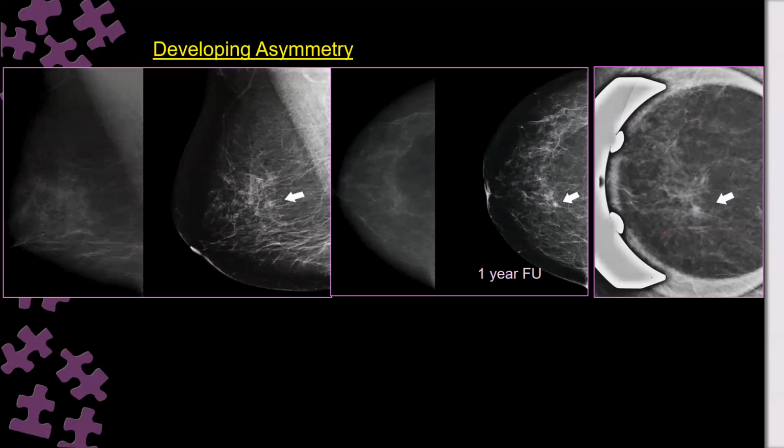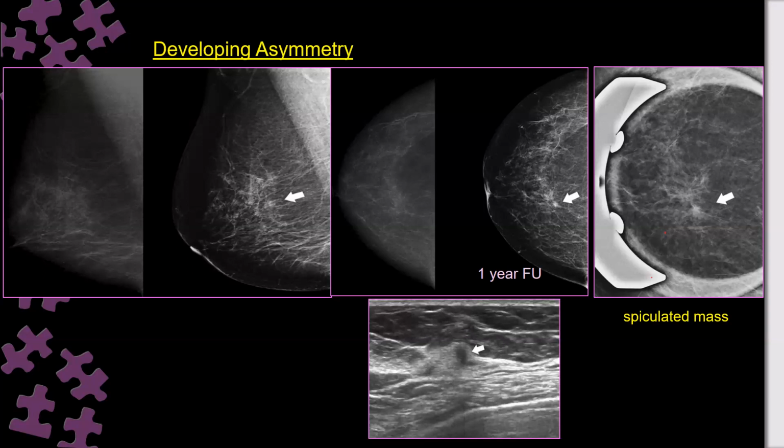What is next to here? So here, what is next? Ultrasound and biopsy. Excellent. For biopsy, go for ultrasound if you can see it, to make sure that it is the same, and take a biopsy because ultrasound is easier. That was ultrasound. You see the lesion on ultrasound, and it was invasive ductal carcinoma.